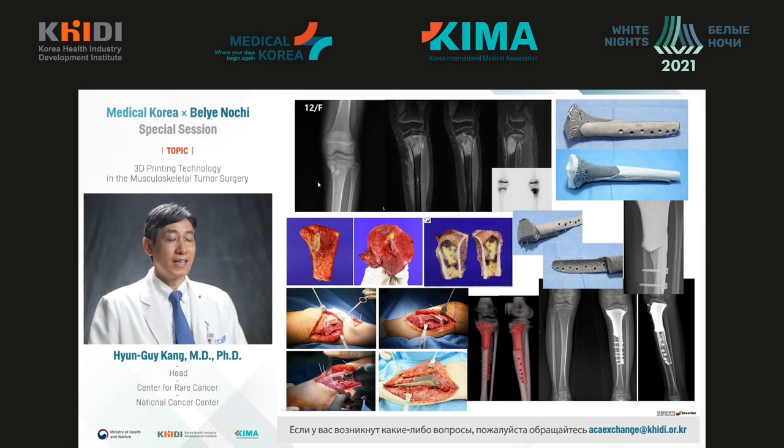Another patient had sarcoma of the proximal left tibia. In order to save the joint, we used special guiding wires for the osteotomy and implant. It was a successful result. During chemotherapy, no infections developed and there were no other functional issues.